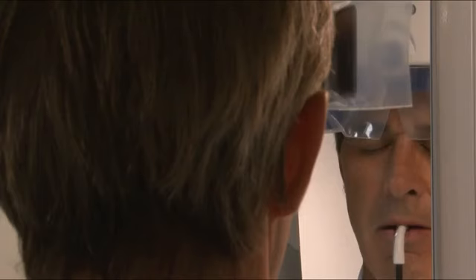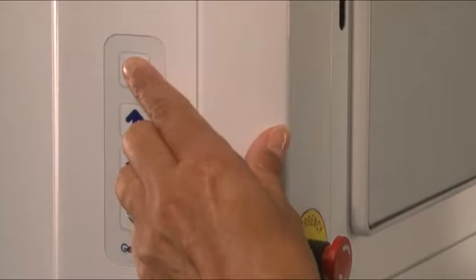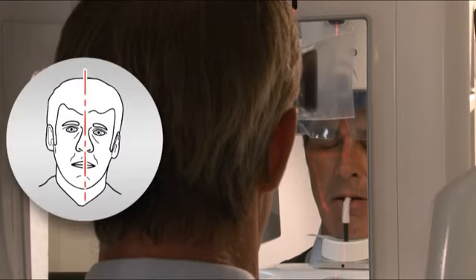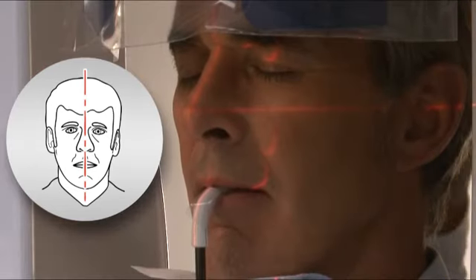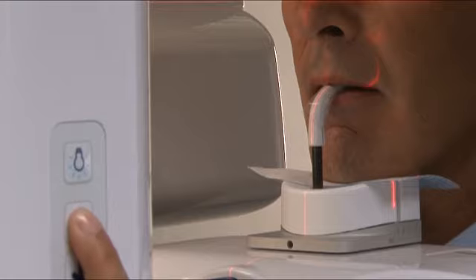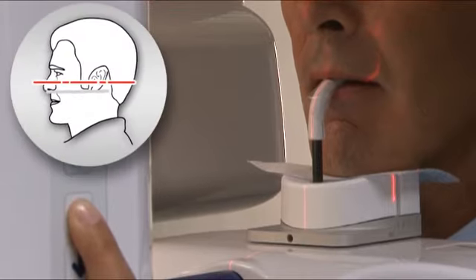Have the patient close their eyes. Then press the laser button to initiate laser alignment lights. For mid-sagittal placement, verify that the patient's head is not tilted or turned to one side. For standard panoramic horizontal placement, use the up and down buttons to bring the patient's Frankfurt plane parallel to the laser.